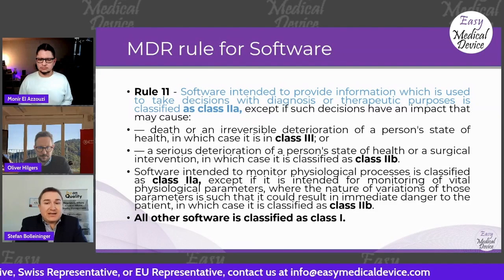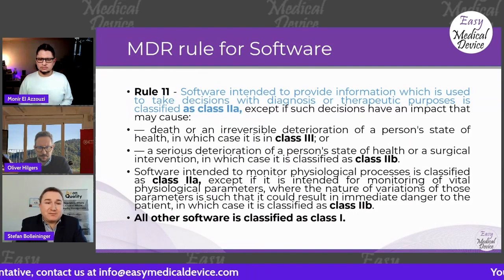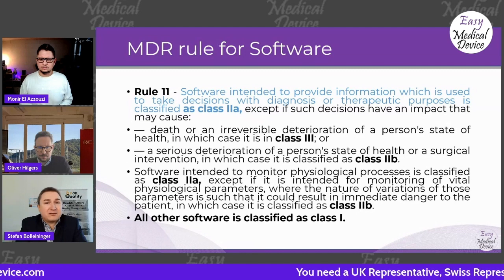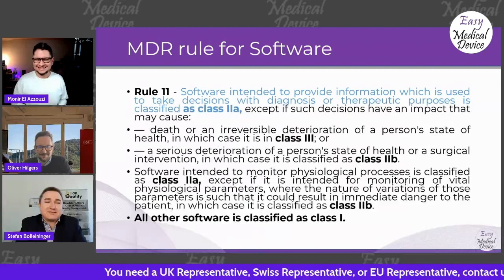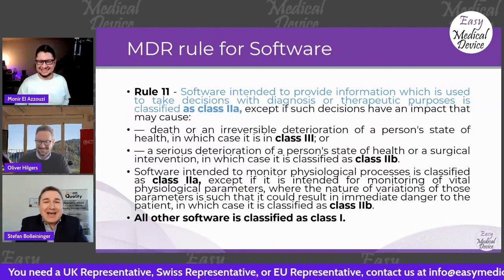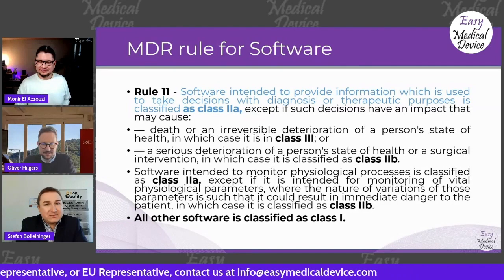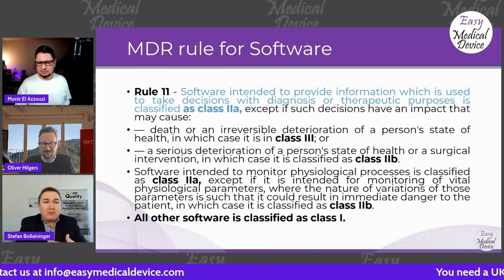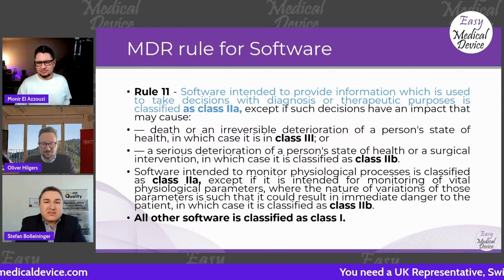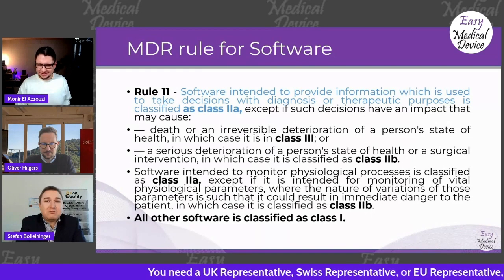And what we have experienced from my side, and I'm pretty sure Oliver has the same experience, is that there are many software products nowadays on the market which have been class 1 for 20 years, not millions, 20 years. Those tend to have a different focus. So they focus more on the patient side. I'm a patient. I have no clue about diagnostic and therapeutic decisions. So I cannot do that. I am legally not allowed. And also I cannot do it.